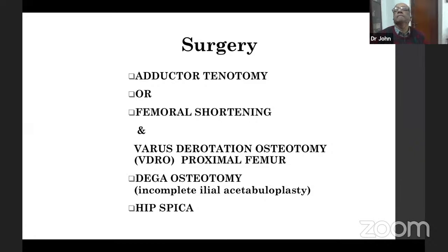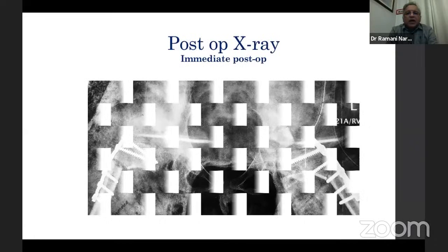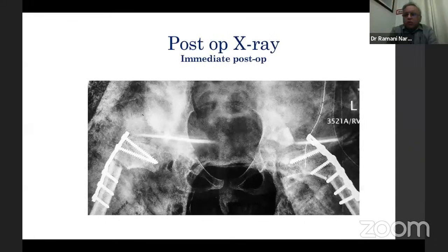Better. All right. So the femoral shortening, derotation osteotomy, Dega osteotomy, hip spica. And this is the post-operative X-ray. So Dr. Gopinath, what do you think about this post-op X-ray? Are you satisfied?